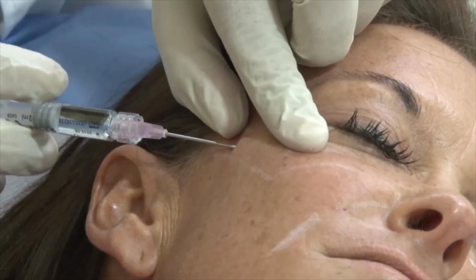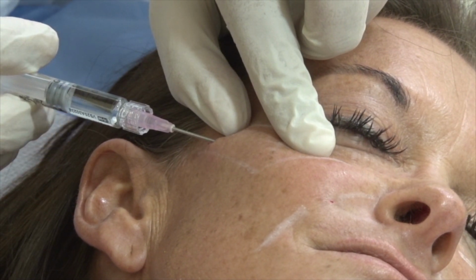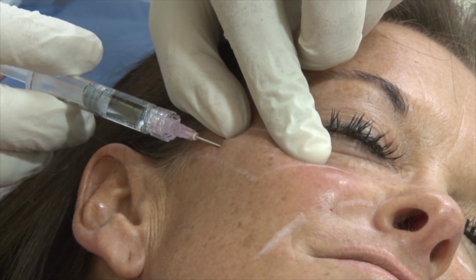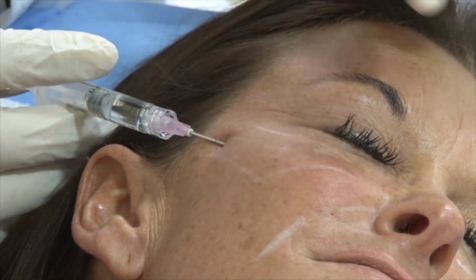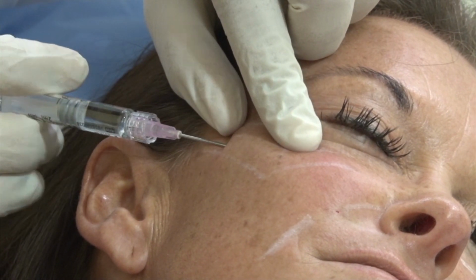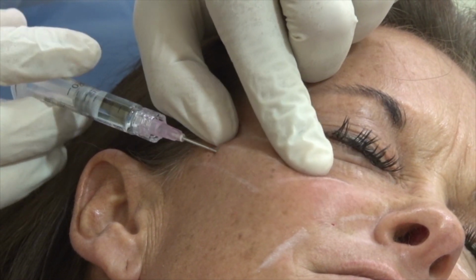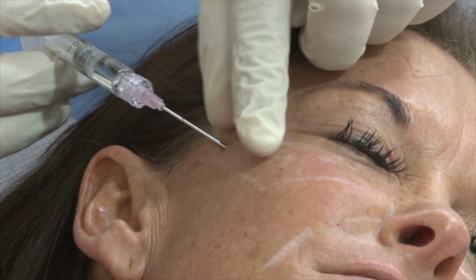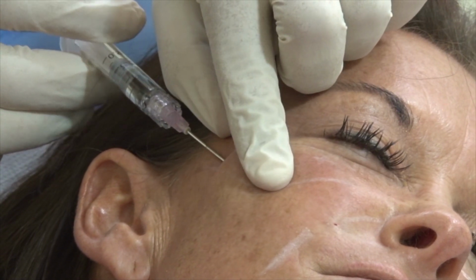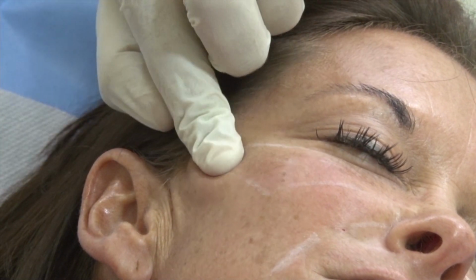So once you have reached the distalmost point where you want to inject, then you start injecting a small quantity, ensuring with the other finger that the placement is correct, and then gradually withdrawing the cannula and injecting it. I inject in a radial fashion, starting from the superior border, going all over the anterior border up to the lower border of the zygomatic arch. So I'm injecting about 0.5 ml of the filler. I'm using a high G prime to give me more volume and projection in the cheek.